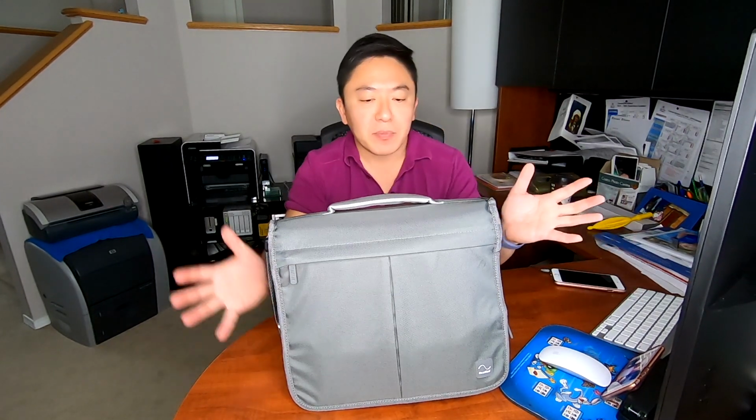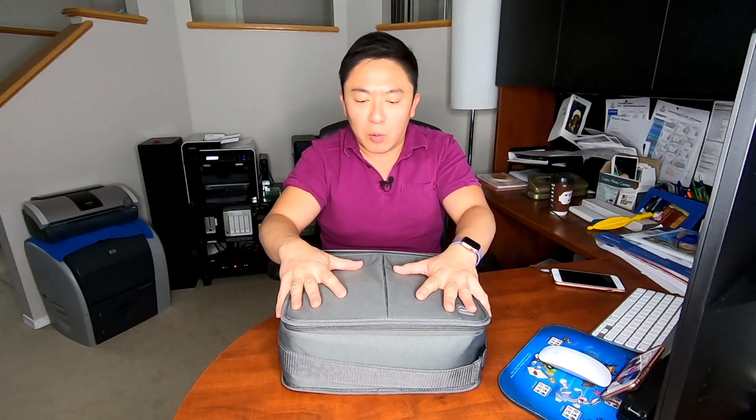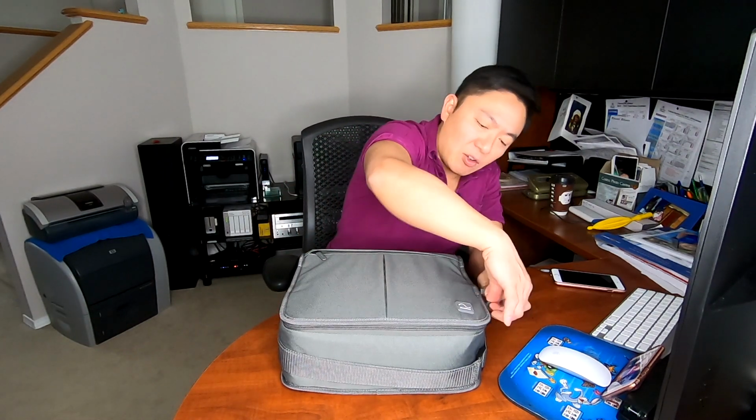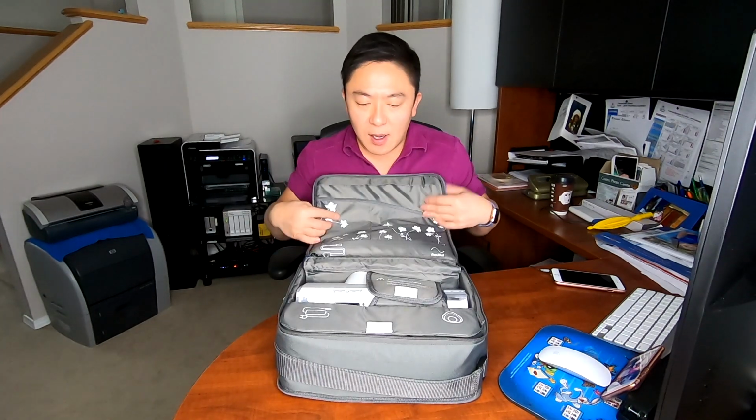So this is what the unit looks like when it comes from the sleep clinic or your durable medical equipment supplier. It's in this bag, not too big. It's about 6 or 7 pounds fully loaded. It makes a great storage bag, you know, well, you should never actually store it at home, but it's a great travel bag that protects the unit and holds everything you need. You can put your travel documentation inside, your owner's manuals if you need to, etc., etc.